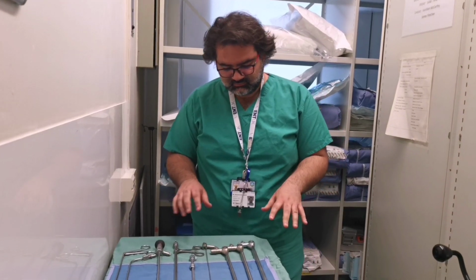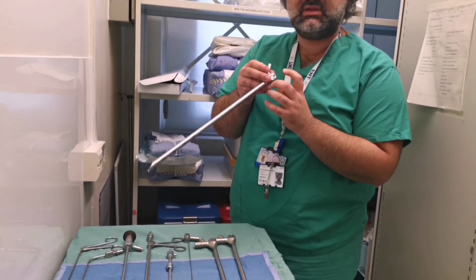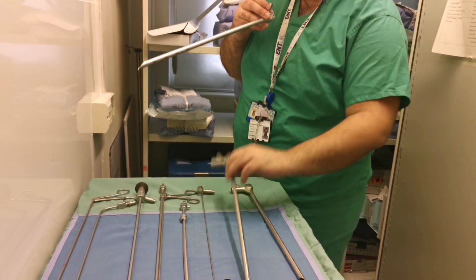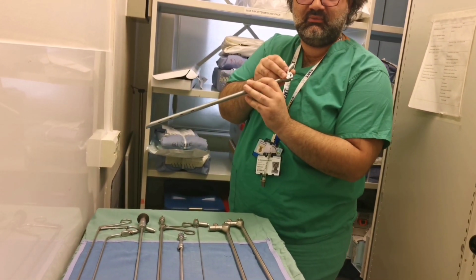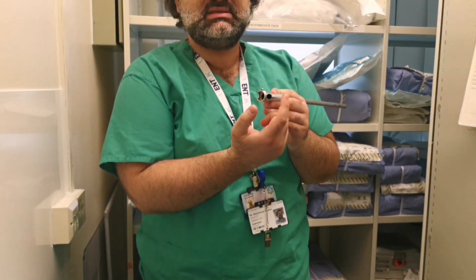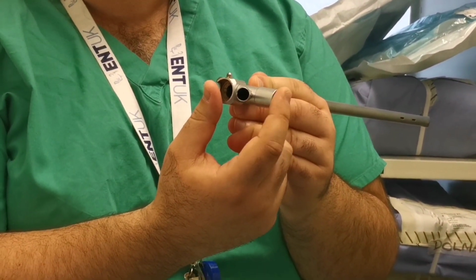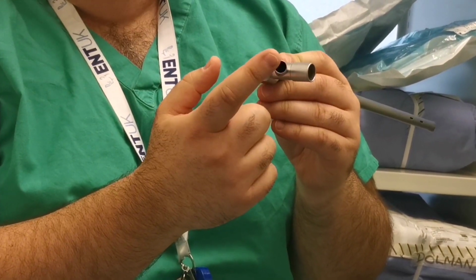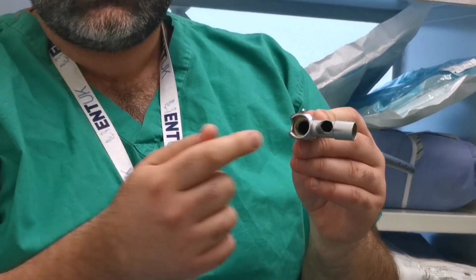Bronchoscope foreign body set. We have 3 sizes of bronchoscopes. We have size 8.5, 7.5, and 6.5. Okay, so essentially how to assemble the ventilating bronchoscope. First, we have 3 openings. This is for the ventilation, so that would be for the anesthetist to attach the airway. And this is for the flexible suctioning, and this would be our main working area.